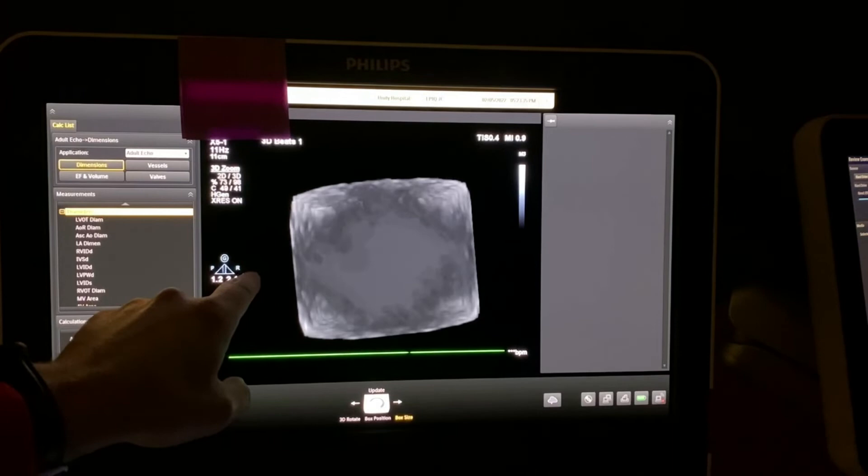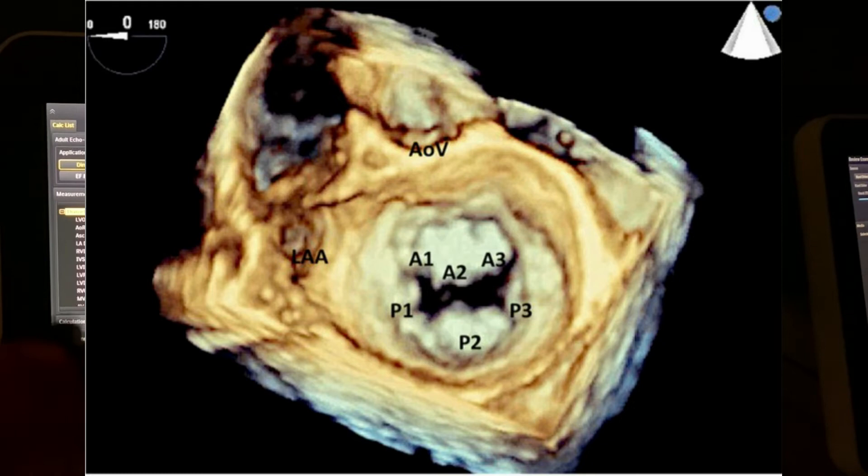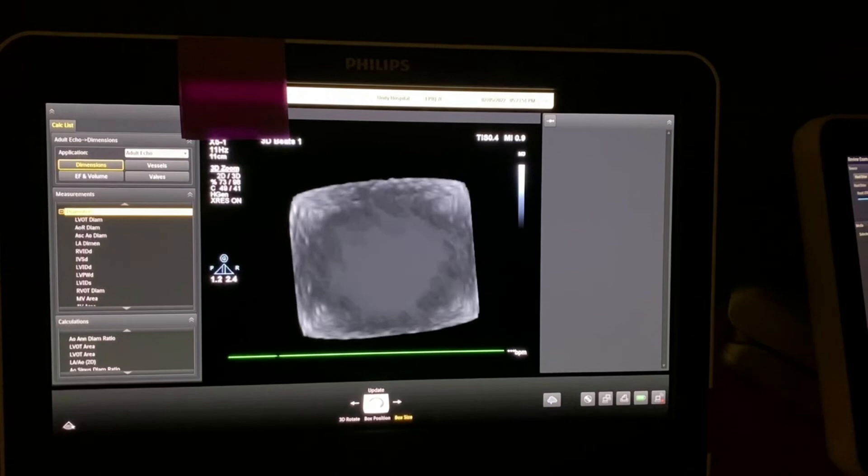Now normally our left atrial appendage exists here, and then we have our aortic valve up here. So this is the anterior leaflet, posterior leaflet: A1, A2, A3, P1, P2, P3. This is medial, this is lateral.